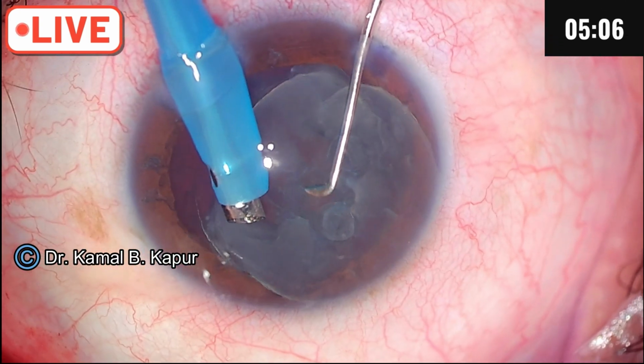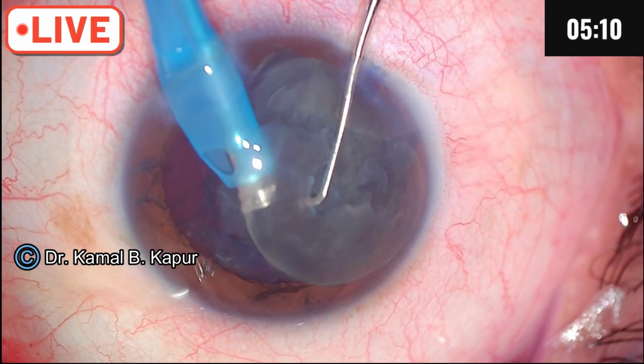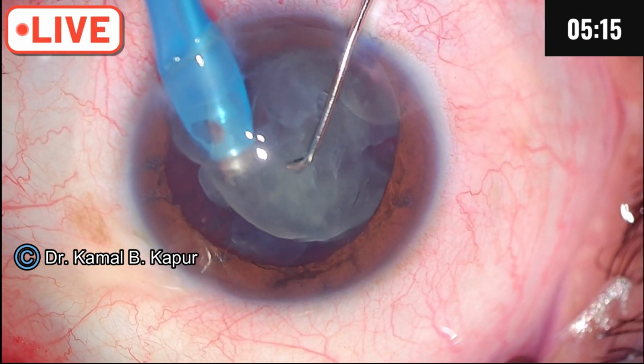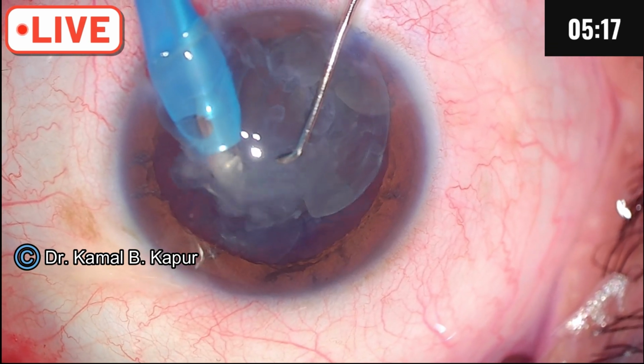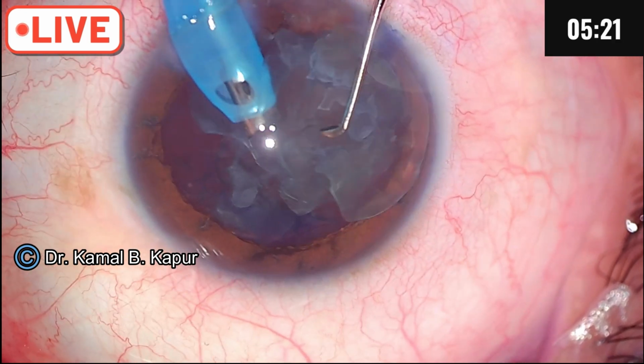So I am carouseling the cataract out. So I will do the carousel technique here. I have tilted the phaco tip, and there you are. You can see the cataract beautifully come automatically into my phaco probe.